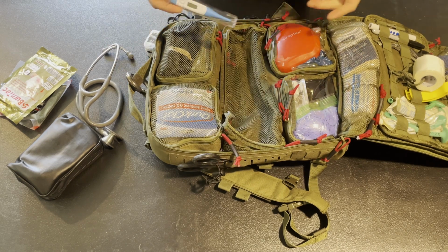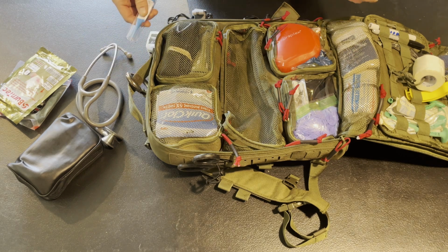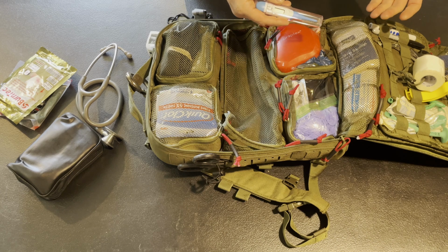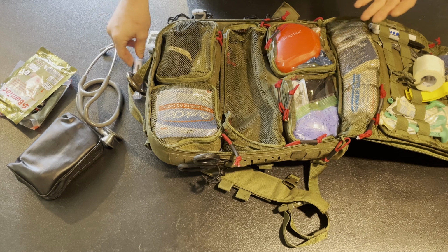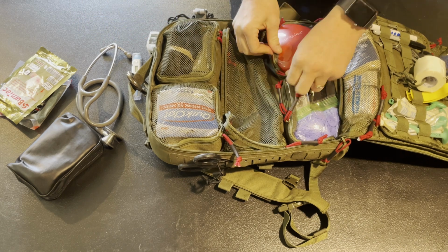Why is it important to have a thermometer? You've got to know your patient's temperature, especially if they're going to be hypothermic or hyperthermic. And also, if you're going back to being a medic for soldiers, I wasn't a medic in the military, but if you are your team's medic, you need to be able to not only treat them when they're injured, but also treat them when they're sick, right? Being your team medic doesn't necessarily stop when the bullets stop flying, right? So you need to be able to take care of your guys no matter what.